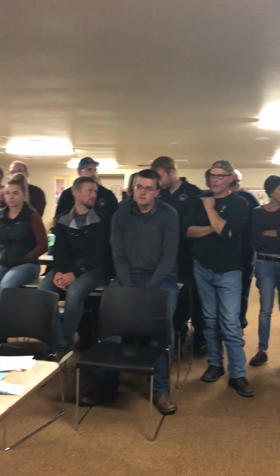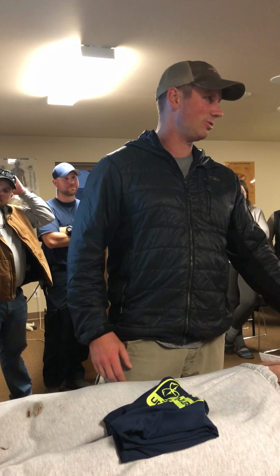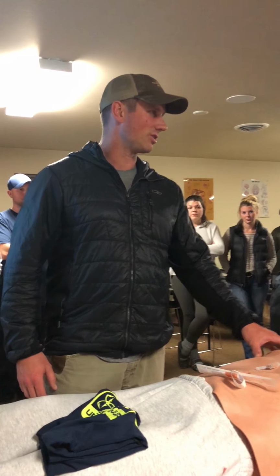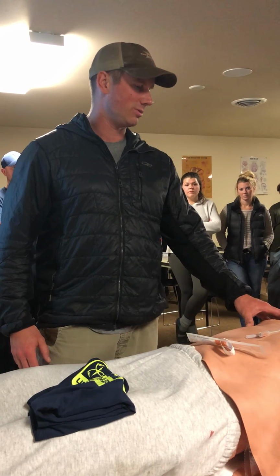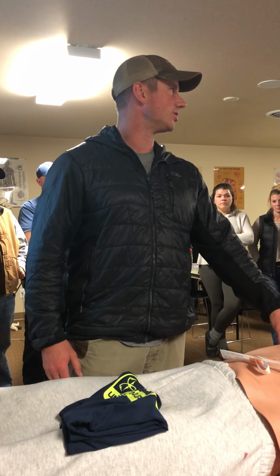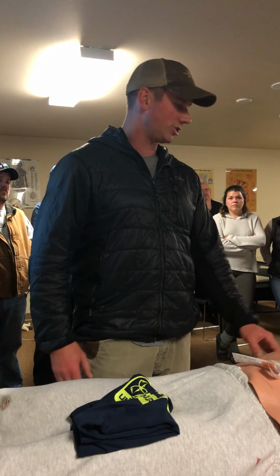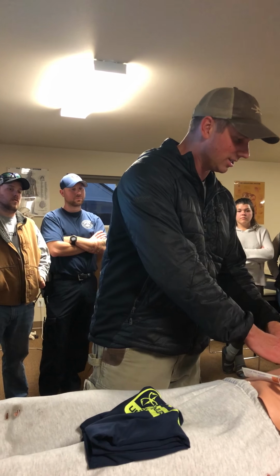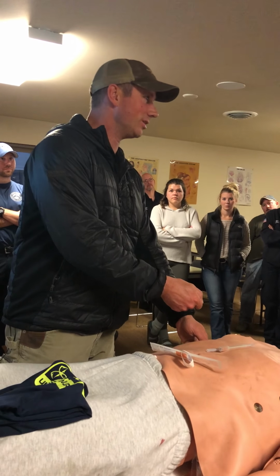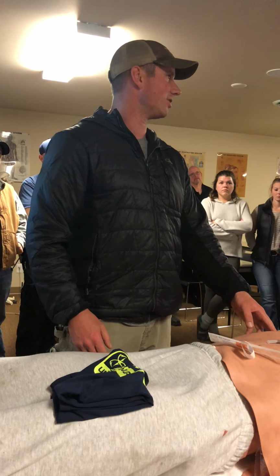What he's talking about is a technique for someone who is really sick with multiple trauma. Some systems are doing needle decompression, but some ERs and resuscitation centers go straight to thoracostomy with the finger. They prep the site like they do for a chest tube, make a skin incision, and then put a curved Kelly clamp in right over the rib and open up the chest. If they get a return of air, they'll put a chest tube in later.